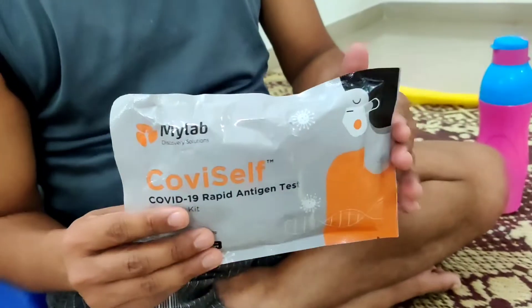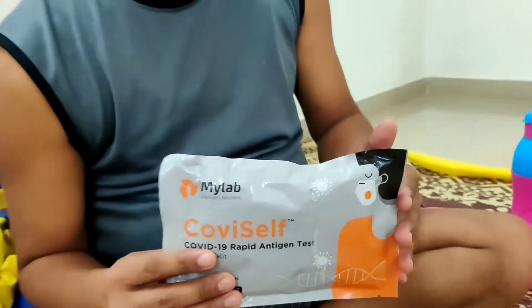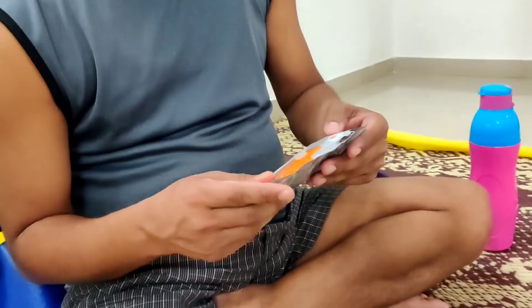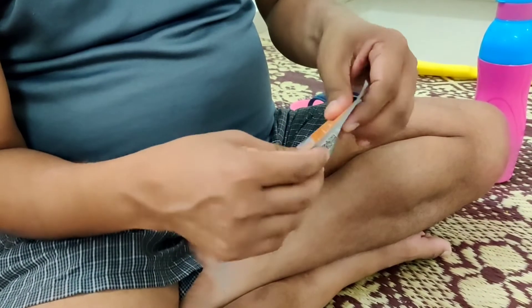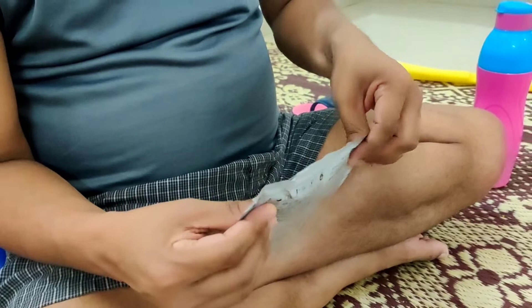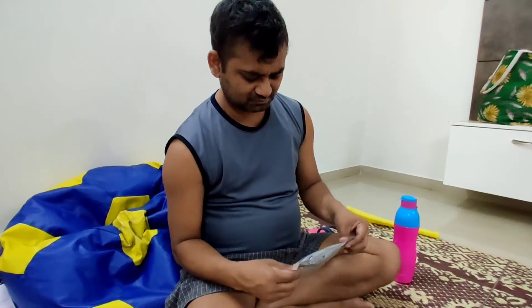We have ordered this self home kit antigen test. It takes 15 minutes and you can order it online. Before using it, wash your hands properly.